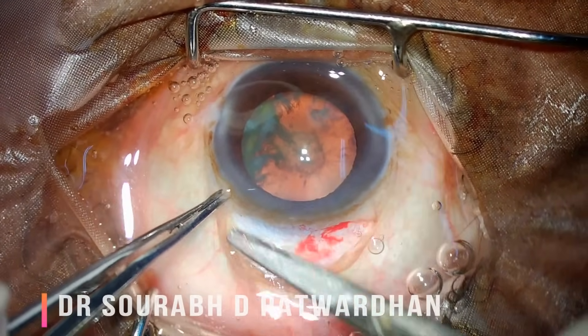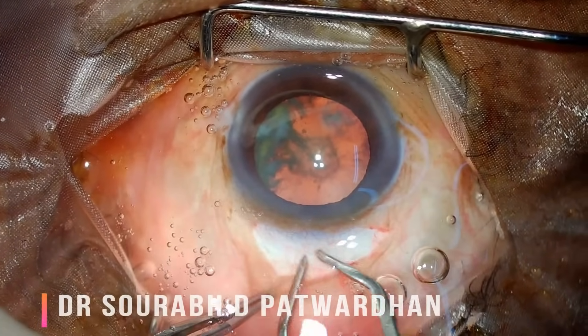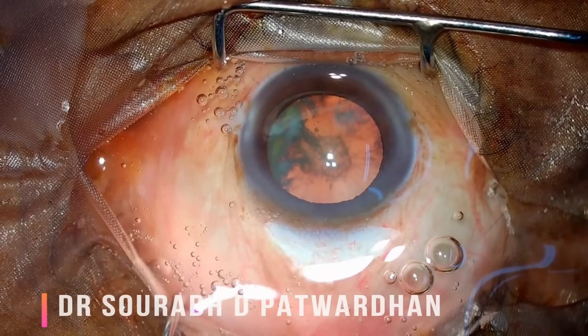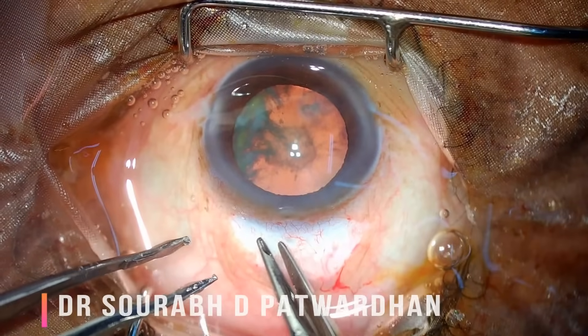For peritomy, there is no need for excessive peritomy — I sometimes see surgeons doing just enough for the scleral tunnel. Do very mild cautery; do not make the whole area white because we do not want excessive scarring later.